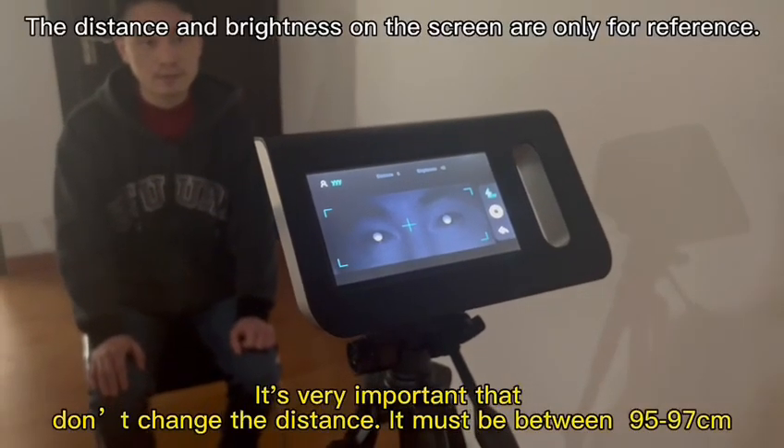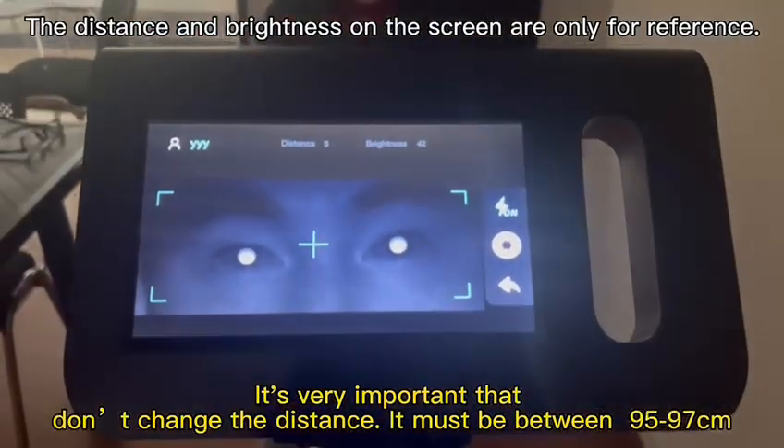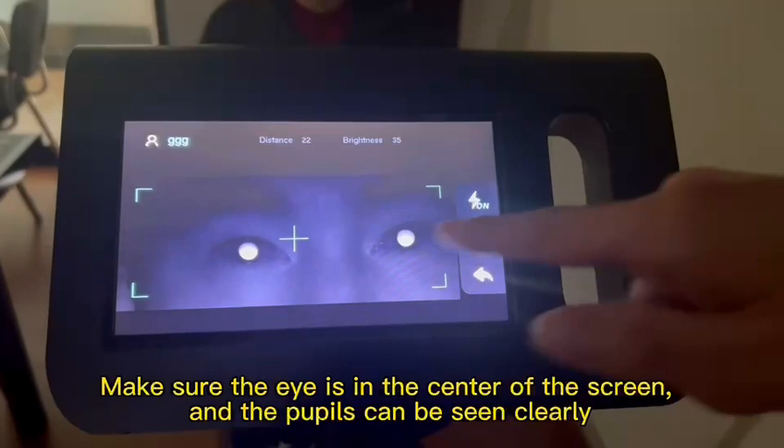It's very important: do not change the distance — it must be between 95 to 97 cm. Make sure the eye is in the center of the screen and the pupils can be seen clearly.